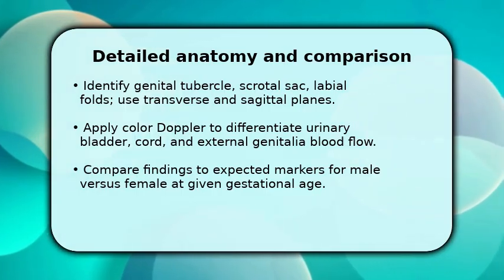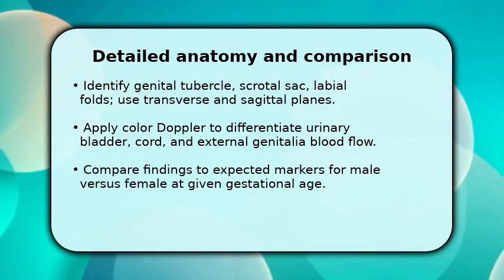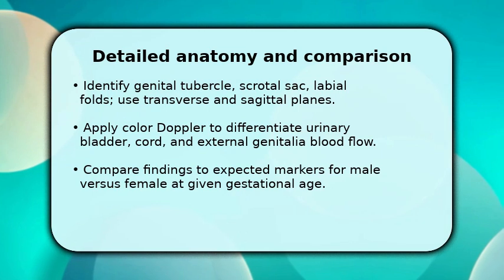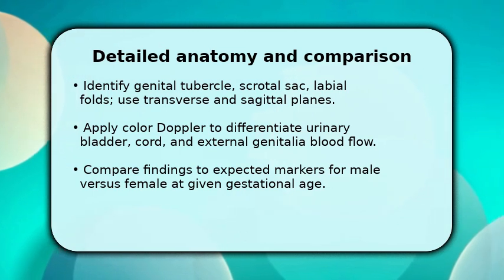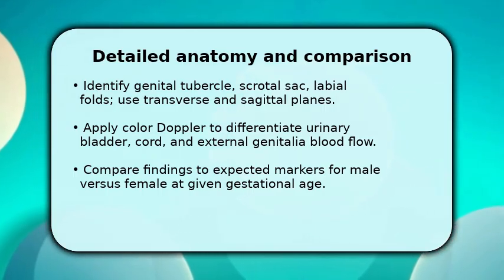Then, compare what you see to expected morphological markers for male versus female at the specific gestational age. If ambiguous, obtain alternate views and measurements, capturing labeled stills and cine clips for the report and for peer review.